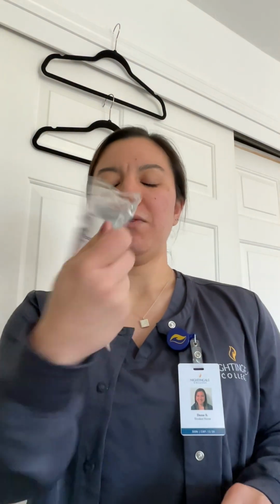So I'm going to go ahead and gather all of my materials. I have both my IV tubing piggyback. I have my 250 mLs of sodium chloride, and I have my 100 ml of sodium chloride with the amoxicillin inside of it. So I'm going to go ahead and do my drip factors first.